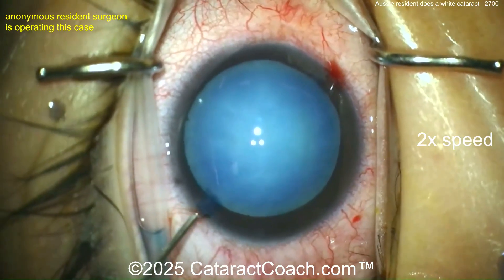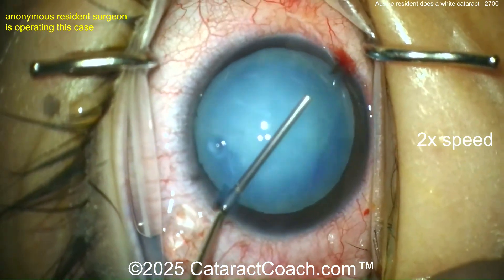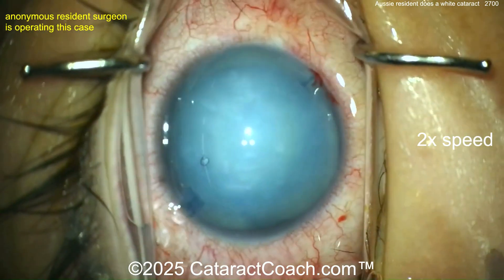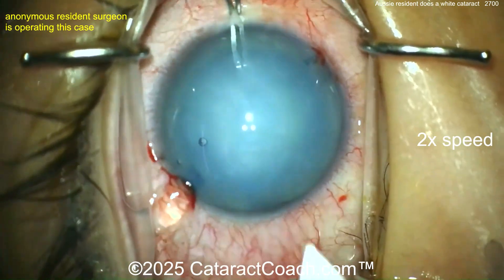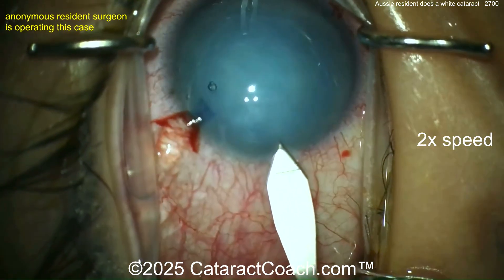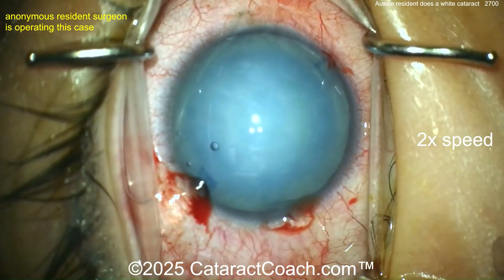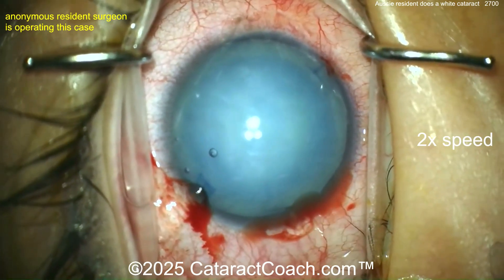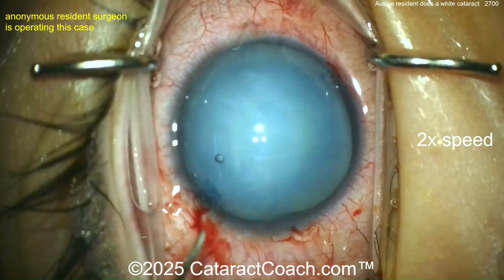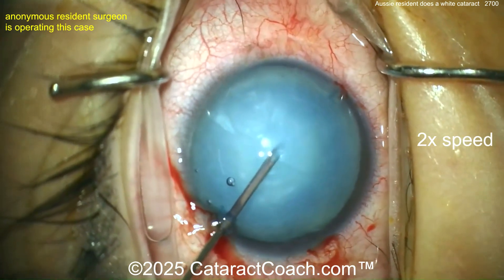There's the eye dilated out with the trypan. Let's see the viscoelastic going in — a good fill from across. That's not an overfill, or maybe it's a big myopic eye. A little bit of an overfill of the viscoelastic there, which may mean the incision could be a little on the shorter side. It's a tolerable incision — pretty good, maybe not too short. The issue you get is when the eye is hyper-inflated and the pressure's up, you may end up making a shorter tunnel length for the main incision.